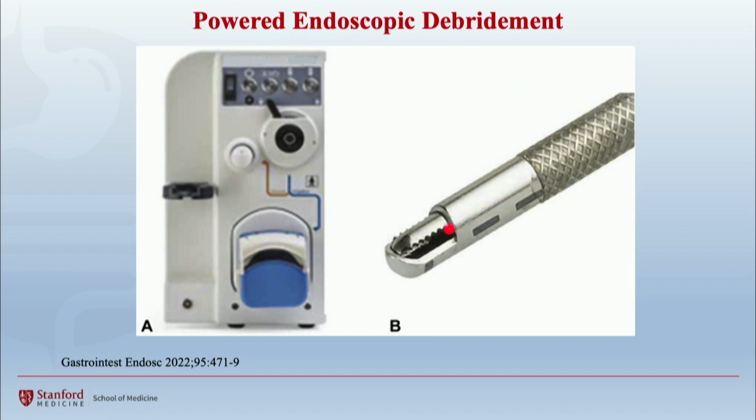It's called the EndoRotor, and it has a spinning knife in the middle, connected to suction. The knife spins at a rate of more than 1,500 RPM, and at the same time it suctions the fluid into the space here, cuts it, and eventually suctions it up.